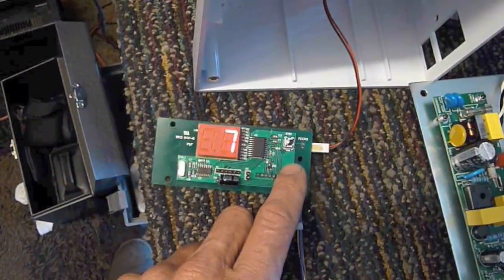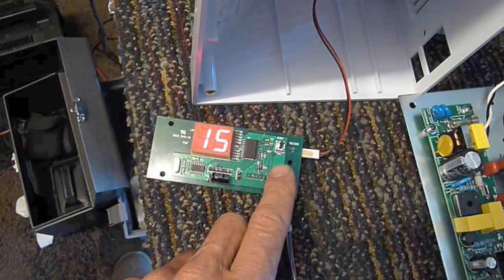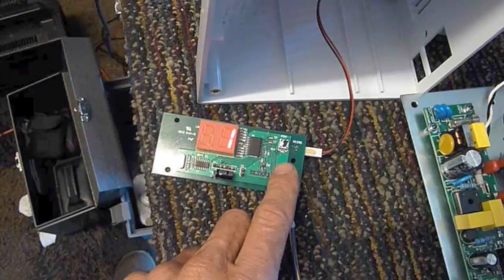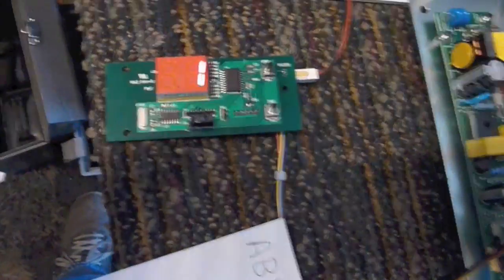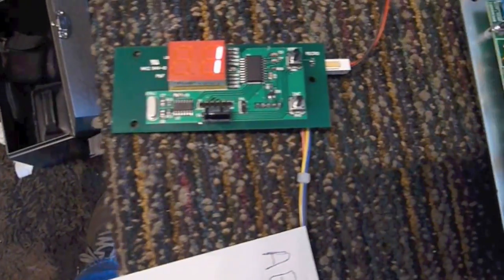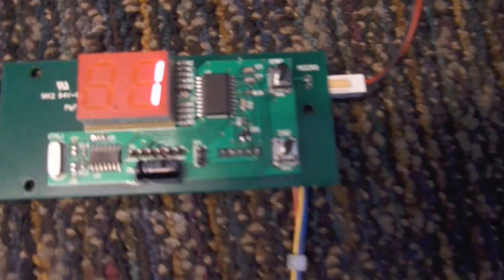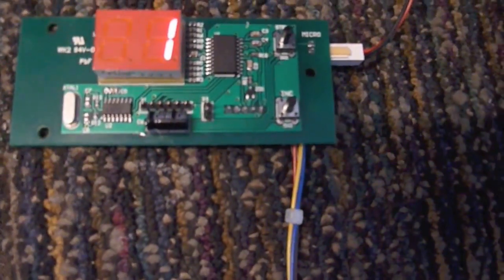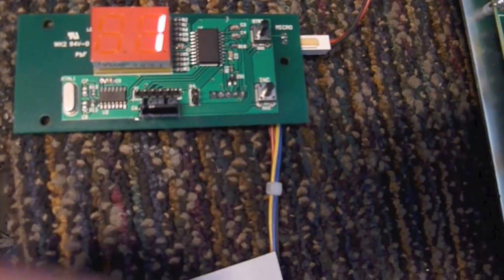Well, when the gentleman brought it in, I noticed that no matter how many seconds I set it for, it would only come on for maybe 1 second and turn off. And in this case, I was looking over the controller board real carefully here, or the timer board, whatever you want to call it. And I could see what appeared to be water damage, little discoloration around some of the connections.